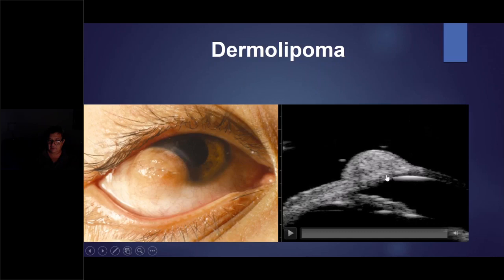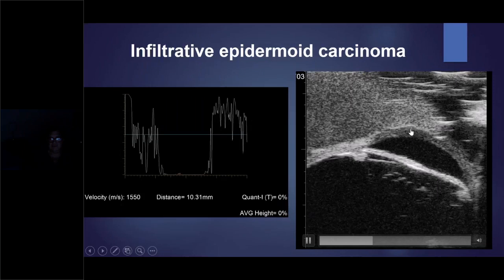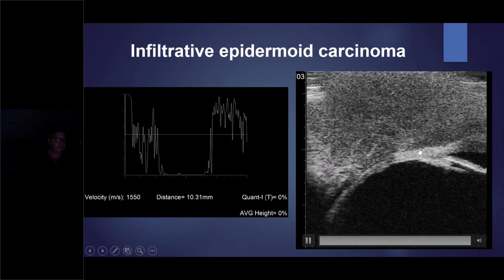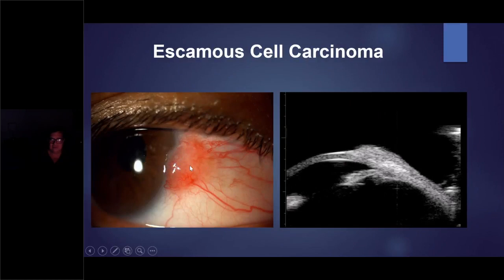In this infiltrative epidermoid carcinoma, UBM is a must. Look at this case. I can see here that the cornea, the sclera, is clear. There is no infiltration. And then when I make the plan of the surgery, it is different. And this squamous cell carcinoma is totally different. Even if it looks a little bit shorter than the other one, it is more infiltrative.